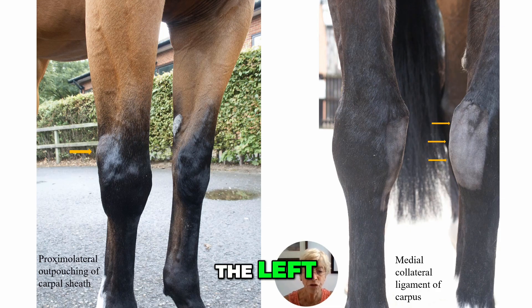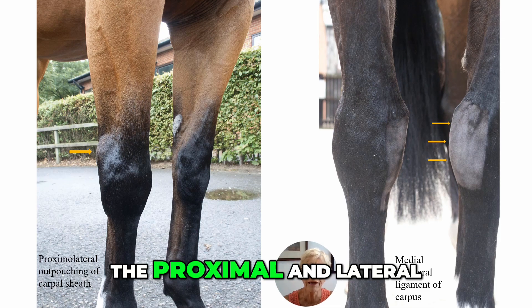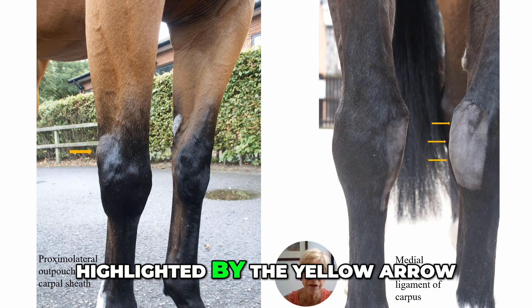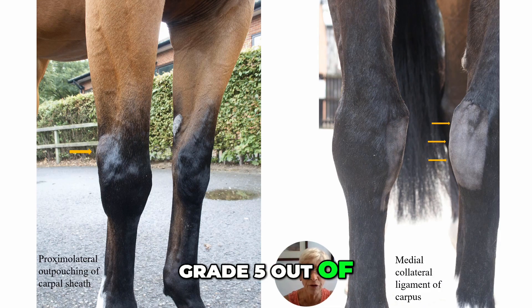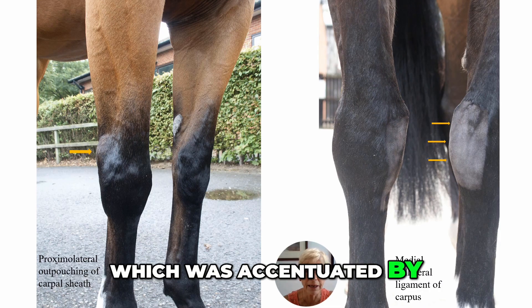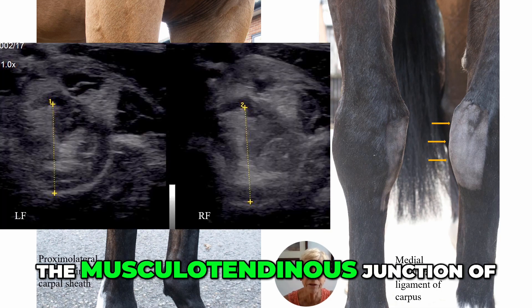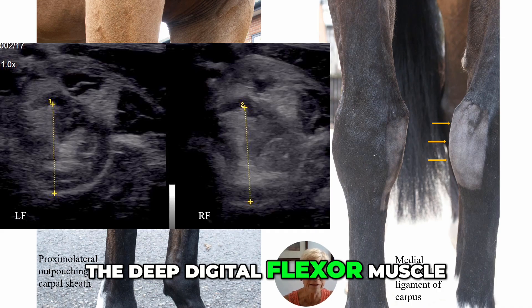In the picture on the left, we can see that there is distension of the proximal lateral outpouching of the carpal sheath in the right forelimb, highlighted by the yellow arrow. This horse showed a moderate grade five out of eight right forelimb lameness, which was accentuated by carpal flexion. The reason for this swelling was injury of the musculotendinous junction of the deep digital flexor muscle.